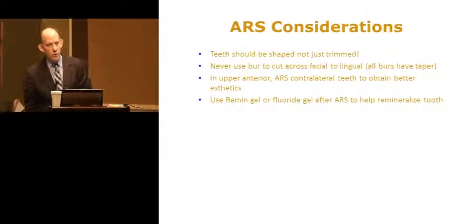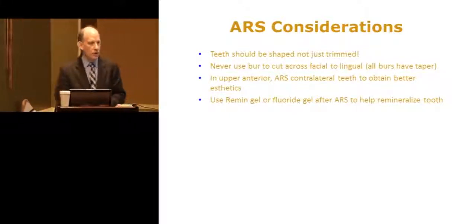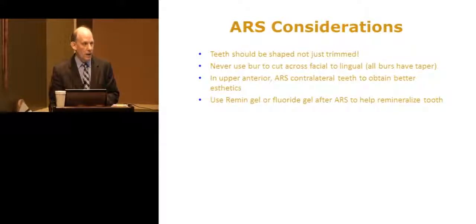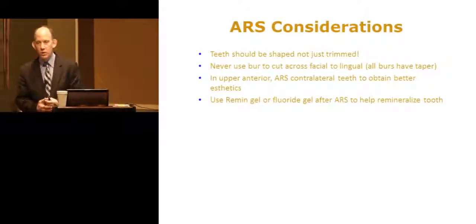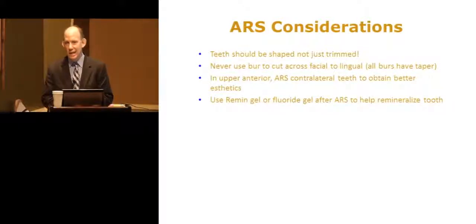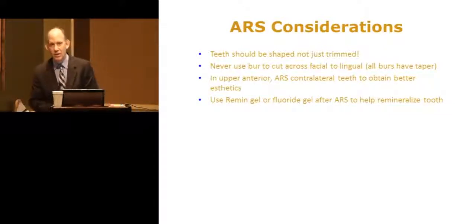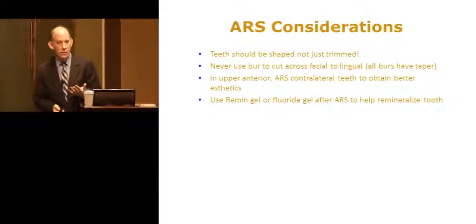When you do air rotor stripping, you have the ability to apply a topical gel format of fluoride to help the teeth remineralize quicker if you're worried that you're a little deep. The reality is, if you contour shaped teeth, the surface will typically remineralize in how many minutes? Do you guys remember your histology at all? Probably not. Guess in terms of minutes or hours or days, how long does it take for a tooth to remineralize? 2 hours. So that's the reality. You're not going to do anything too terrible.